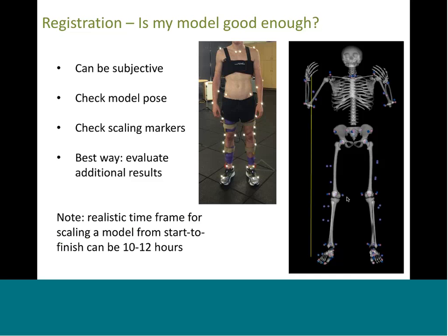Just as a side note, it can realistically take 10 to 12 hours to scale a model to one subject. And how long it takes will be dependent on the data collected, dependent on the marker set used, and dependent on the model chosen.